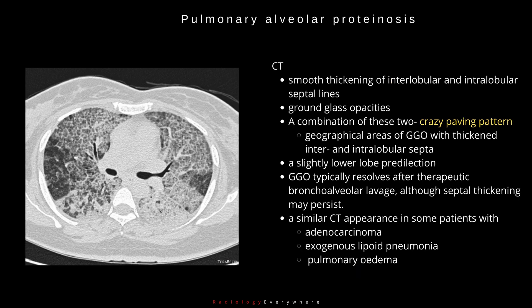On CT, two main features characterize HRCT: smooth thickening of interlobular and intralobular septal lines, and ground glass opacities. A combination of these two features is termed a crazy paving pattern — geographical areas of ground glass opacification with thickened inter- and intralobular septa. There is a slight lower lobe predilection. Ground glass opacity typically resolves after therapeutic bronchoalveolar lavage, although septal thickening may persist.